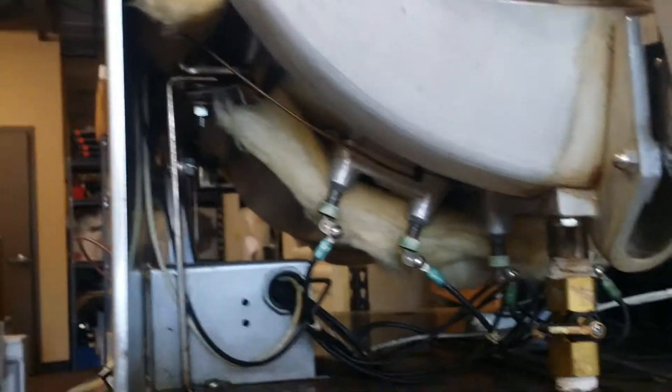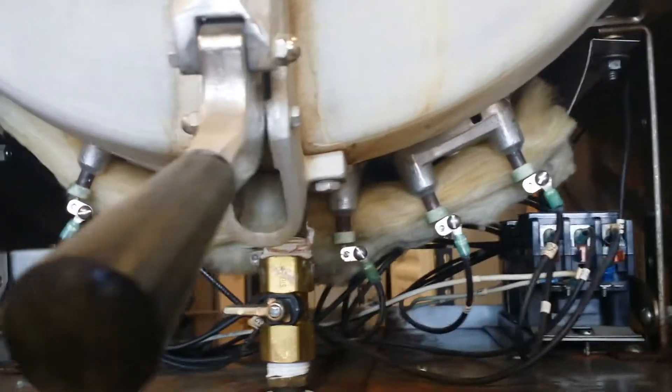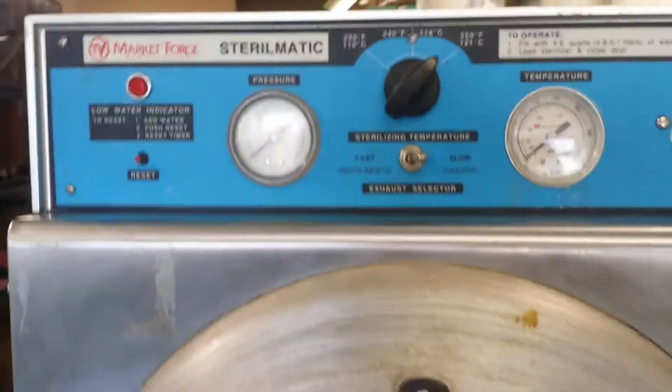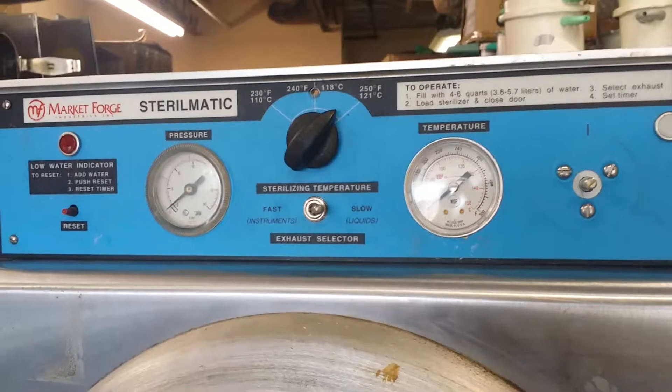On the bottom of the machine, there are three heating elements — one, two, three — and the drain valve. This is a manual machine and is very easy to maintain.